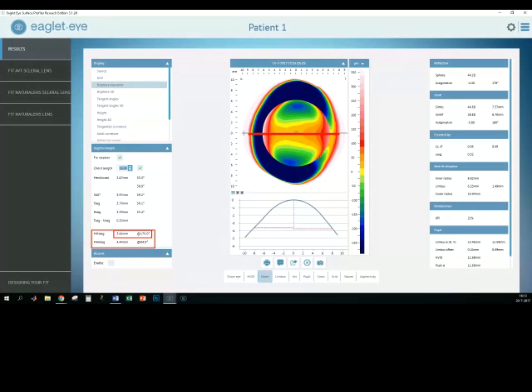And what more can we see is that we're going to look at those two values, that we have to deal with a toricity of 780 micron. 780 micron, that's huge.